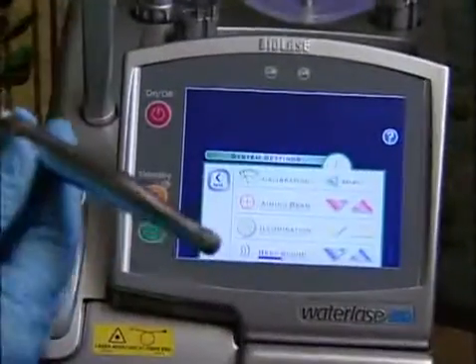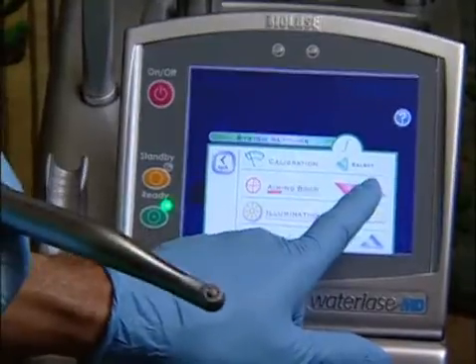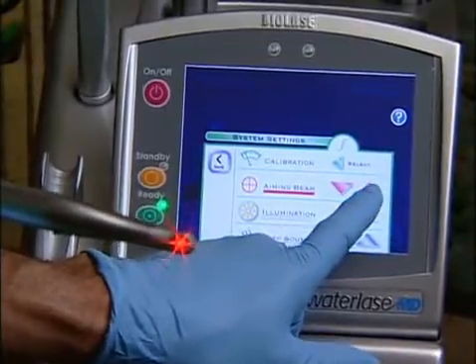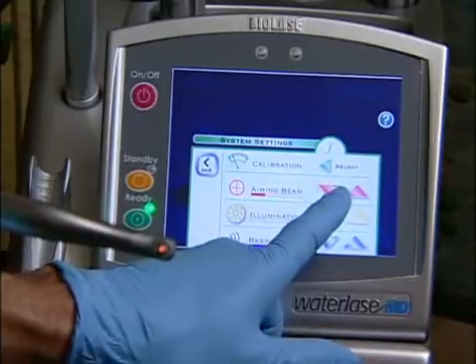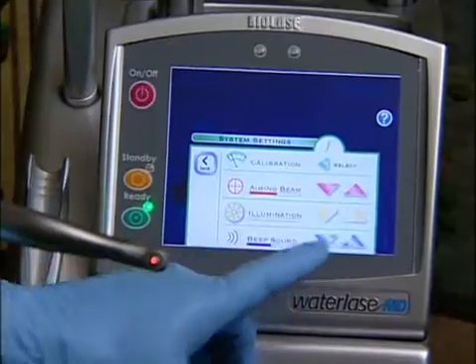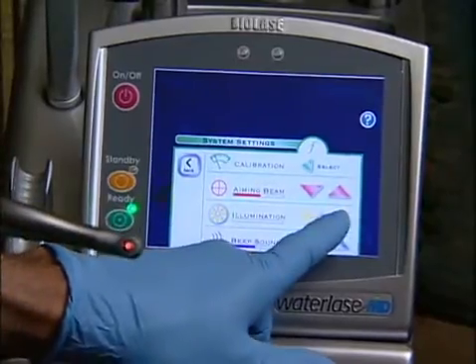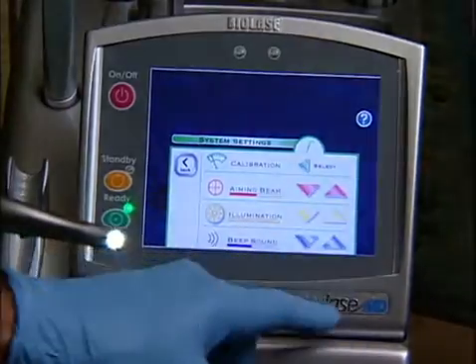The aiming beam, and with the up arrow on the aiming beam, you can adjust the brightness to what you want it to be. I myself like a little bit of aiming beam, but not a lot, so I have it basically right in the middle. Next is the illuminated handpiece, the super feature. Again, up arrow, and I go illumination full strength. I want as much light as I could possibly get in the mouth.